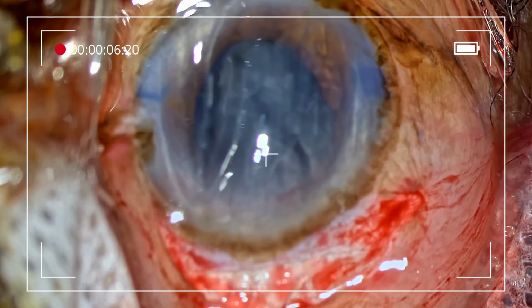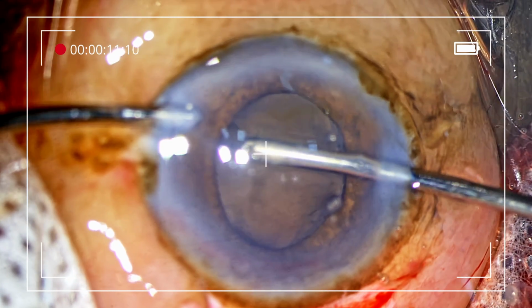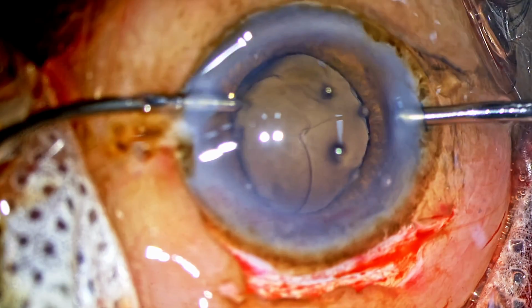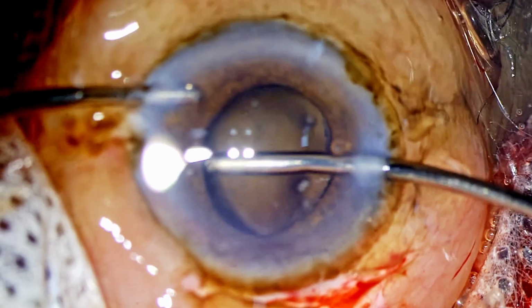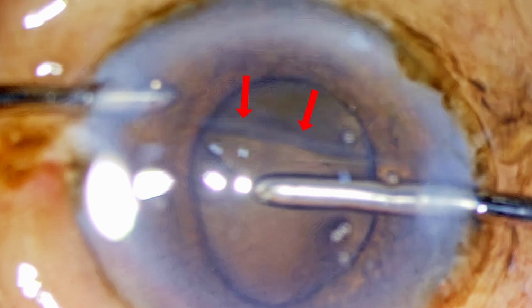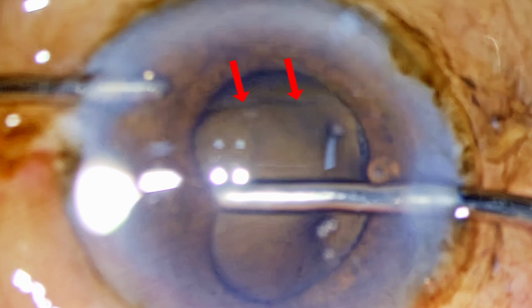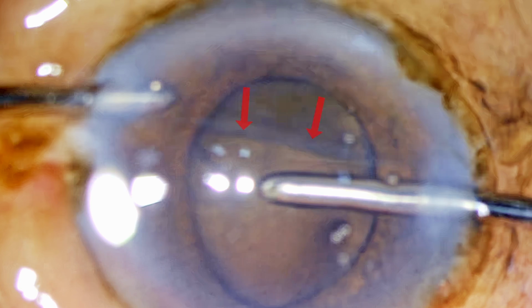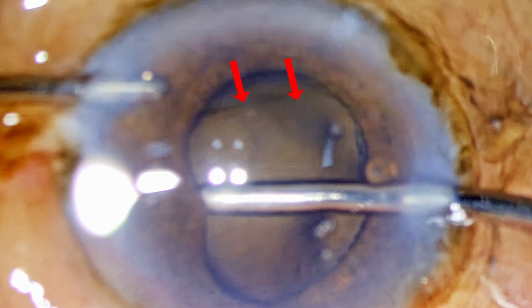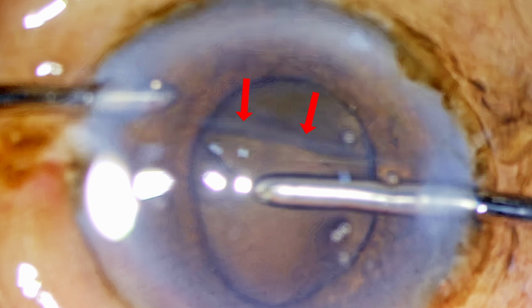Intraoperatively, the surgeon hadn't diagnosed a DMD. He was totally unaware of the presence of any DMD during the surgery, but when we go back and review the case, at this step, when the surgeon is trying to introduce the cannula inside, this is the irrigating cannula, we can see a wave which looks like the OVD getting displaced, but in fact this could be the step in which the Descemet membrane lamellar separation happened. It doesn't have a free edge. So there is a lamellar separation of the DMD, and this was missed intraoperatively by the surgeon.